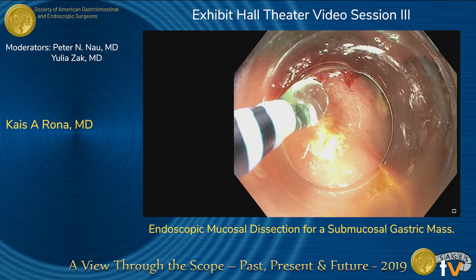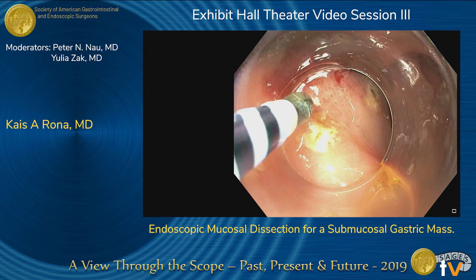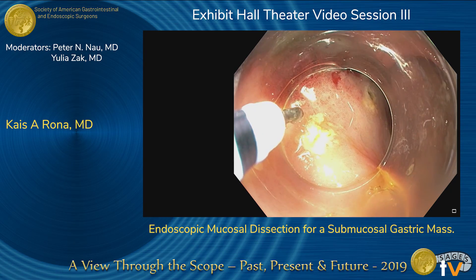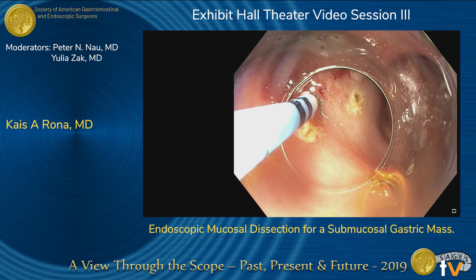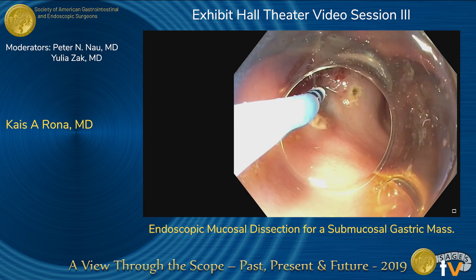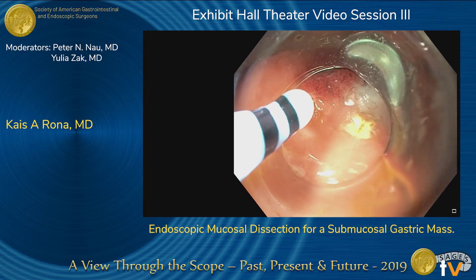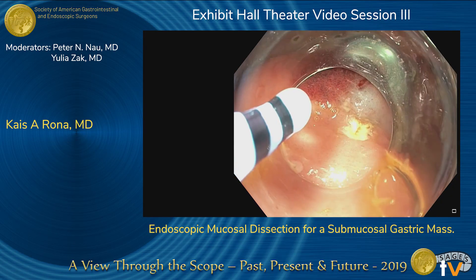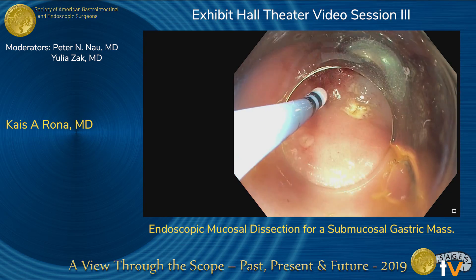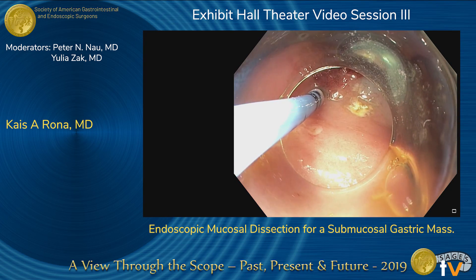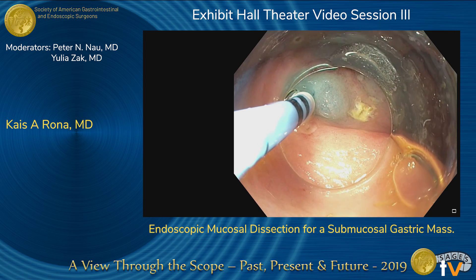An important technique point is to perform the lift posteriorly first. Often, if you perform the lift anteriorly, you create a hill which decreases your visualization of the posterior aspect and makes it more difficult. Here we've performed our posterior lift, and then we perform our anterior lift — you can see that we get a nice lift.